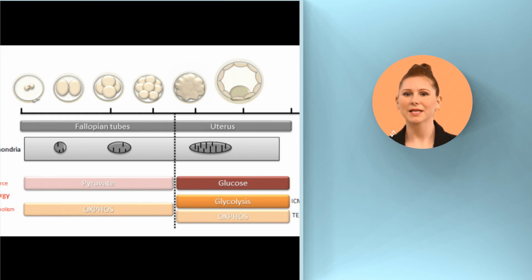Modern embryo culture media was originally designed to deliver the proper nutrients to the embryos when they need it the most, sequentially. For example, a day 1 embryo does not use a lot of glucose as it develops initially. But on day 3, as the embryo starts to make its transition from a multicell embryo toward a blastocyst, the embryo's utilization of glucose goes up significantly. So on day 3, the embryos are moved to a media that has a greater concentration of glucose.